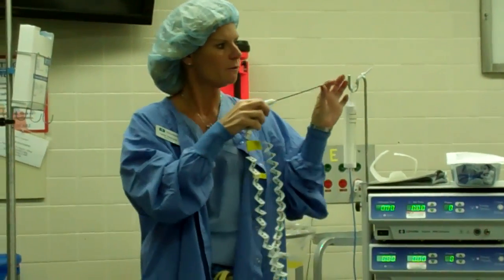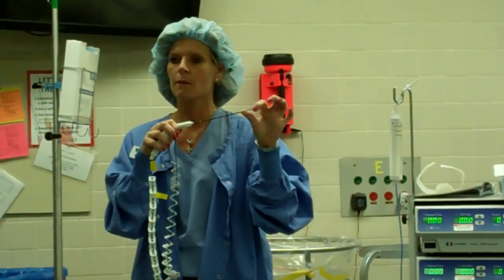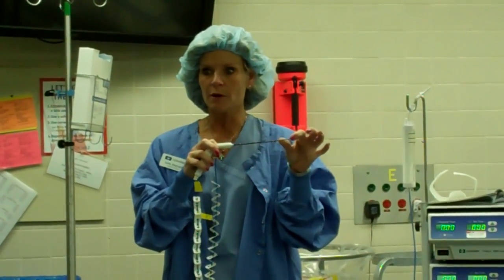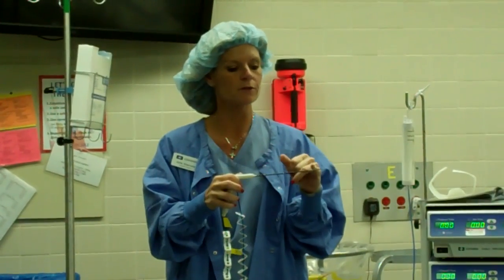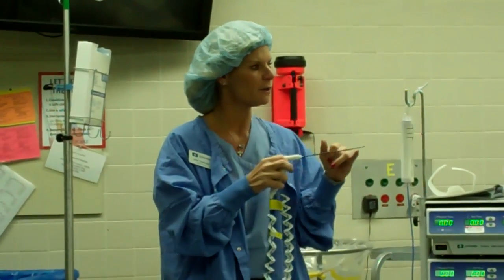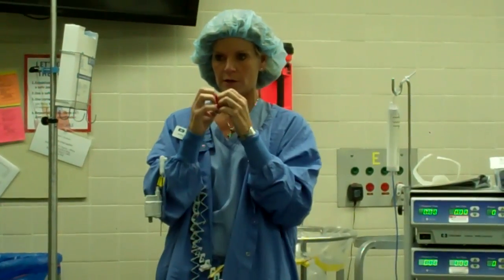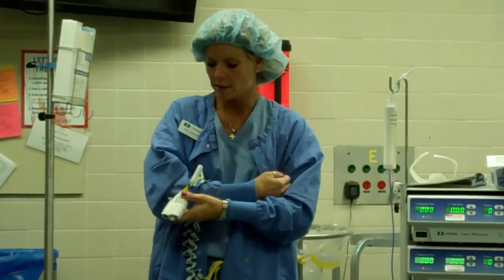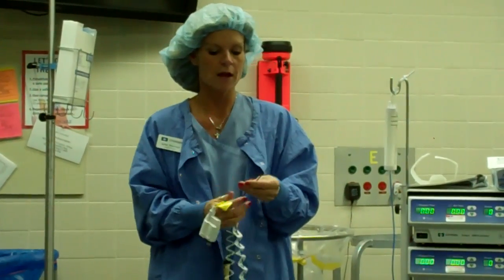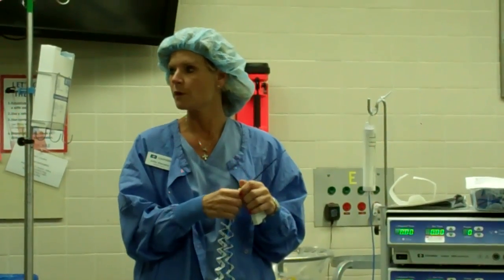This green section here is called your active tip — that's the hottest part. The rest of the antenna will still get warm, but this is really where you're cooking. There's a little red mark in the center which indicates where that energy starts. The energy starts in the center and radiates out, creating that zone of heating. Ideally, Dr. Cheng wants that little red marker in the center of the tumor — that's what he's aiming for.